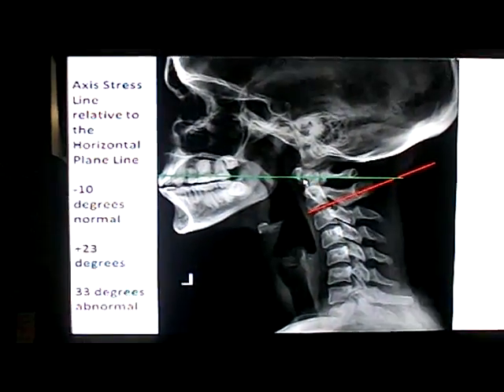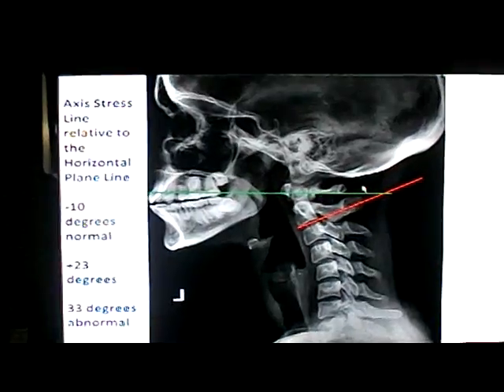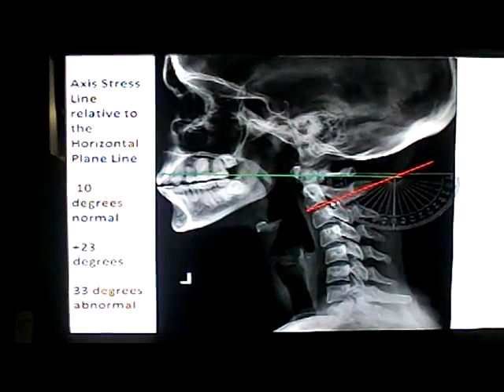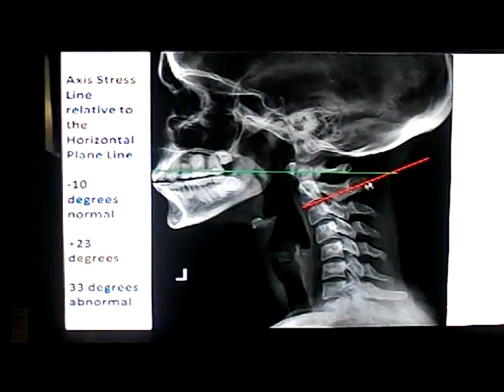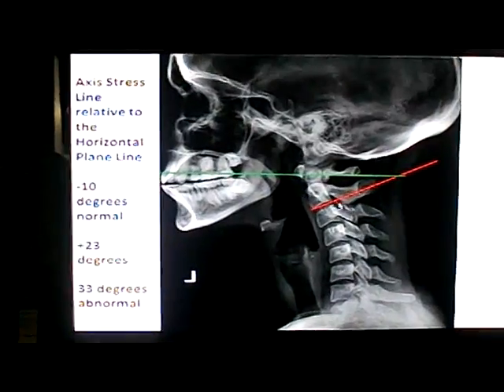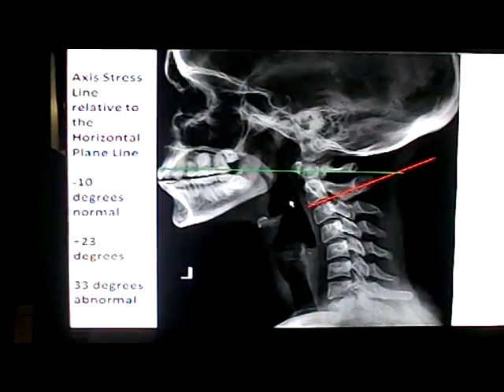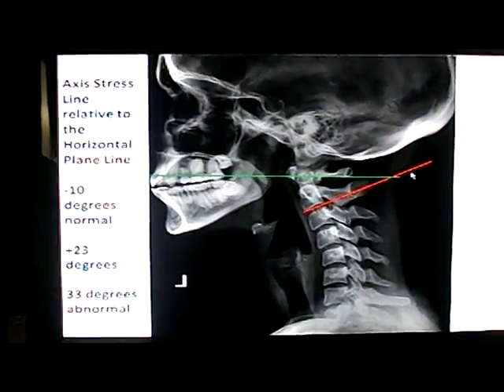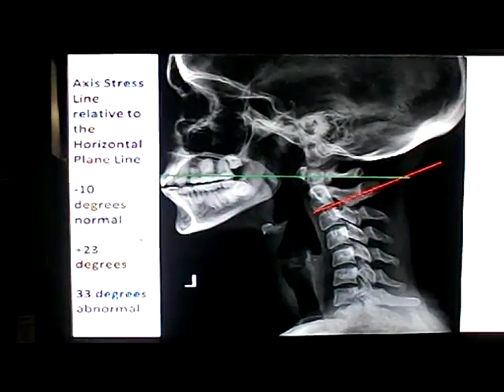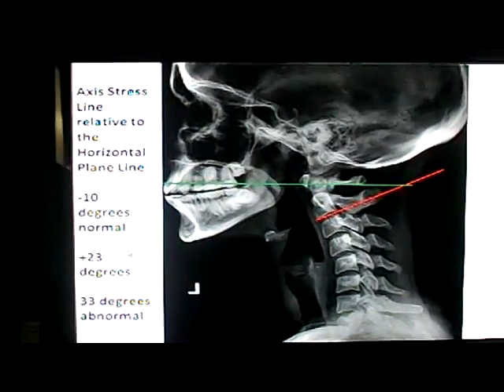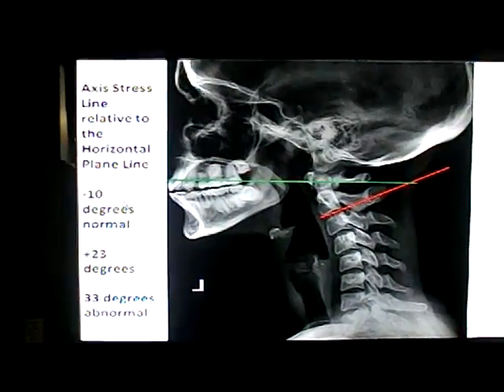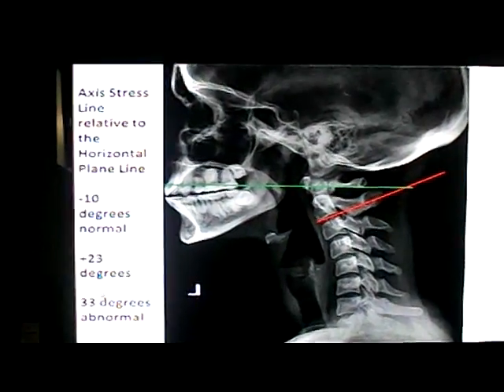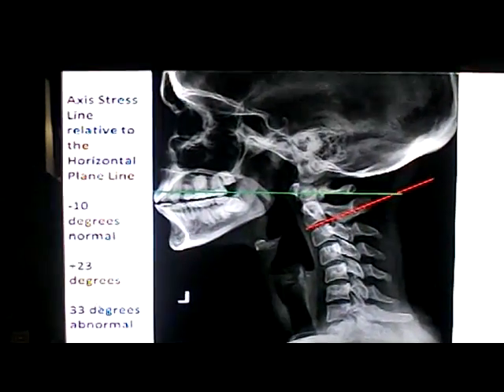When we look at C2 and relate this to a horizontal plane line, the vertebral body's baseline of C2 should be at minus 10 degrees — in other words, it should be going down. You can see this one is considerably superior. This one measures at plus 23 degrees. Now, minus 10 degrees is normal, so we've got a measurable subluxation here of 33 degrees.